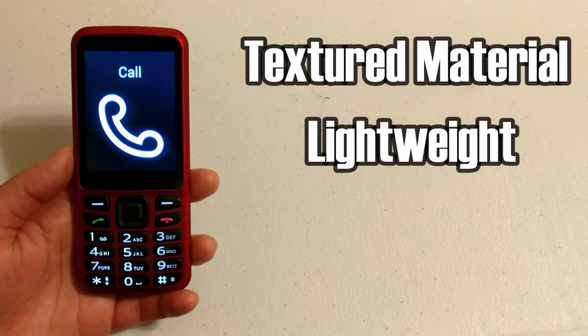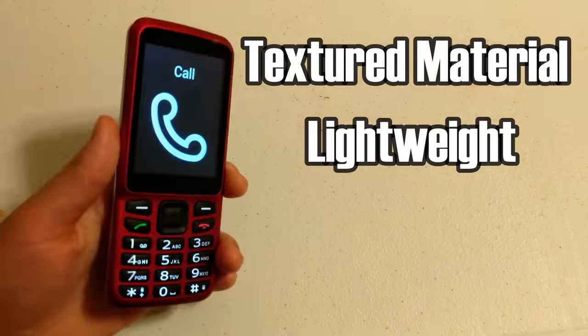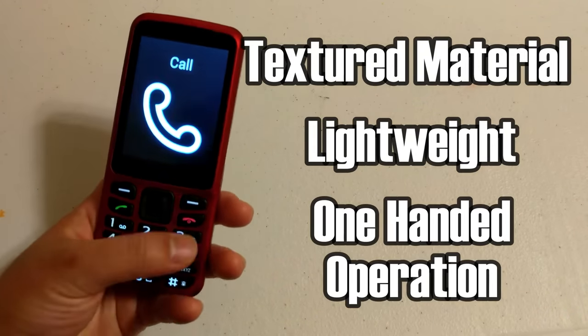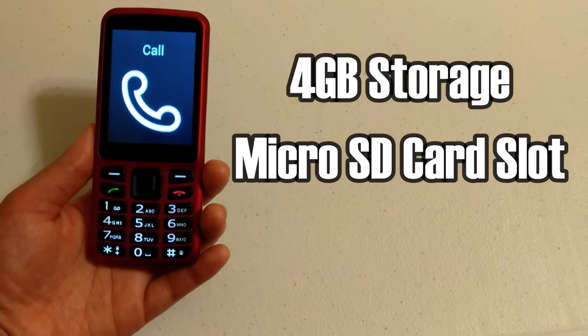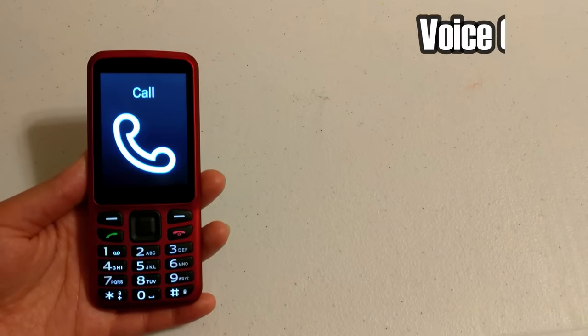It is smaller than the smartphones we have today but it feels just right in the hands — really nice, actually. You can definitely use this with just one hand and reach all the buttons. It comes with 4 gigs of internal storage and you can use a micro SD card. It has Wi-Fi, Bluetooth, and GPS.